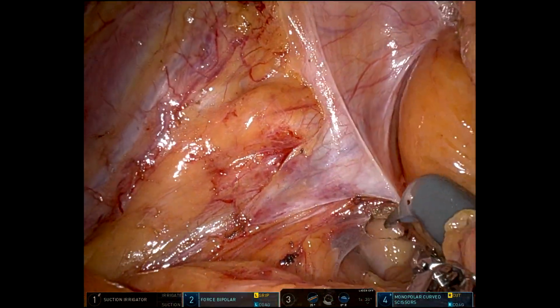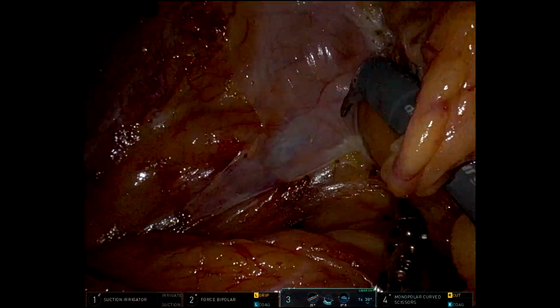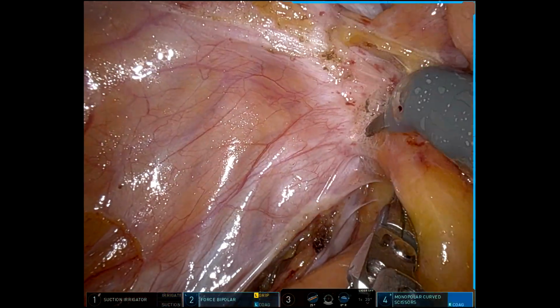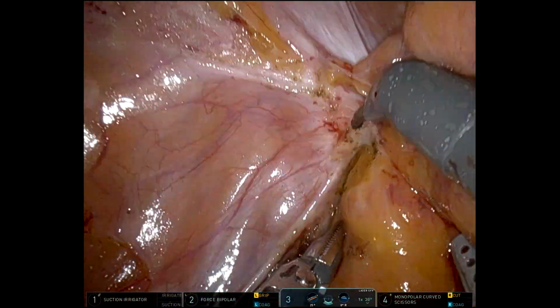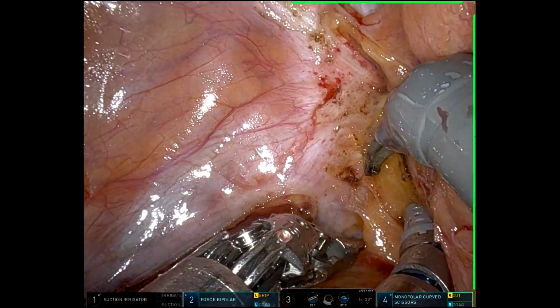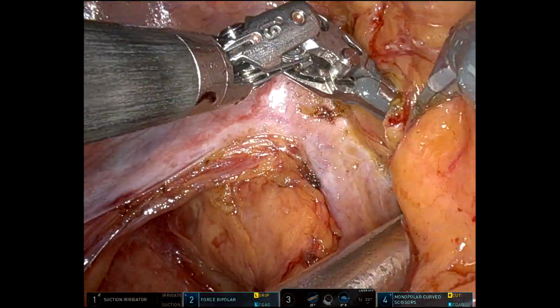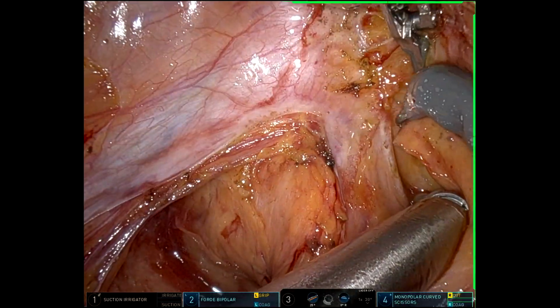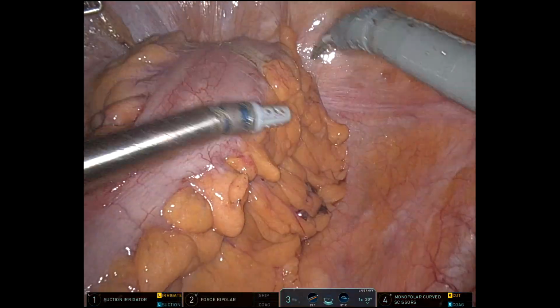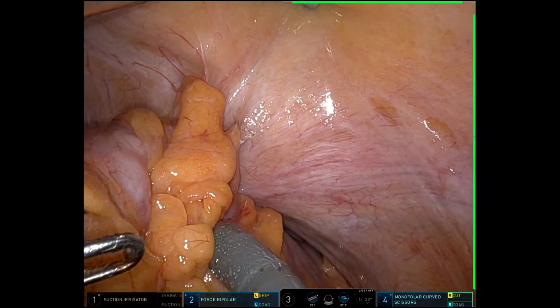So now I'm going to go down towards the pelvis and try to take down the adherence of the fistula. There's some adherence centrally around the dome of the bladder, but there's also some adherence towards the left and closer to the trigone than it looks. So I'm really trying to hug the colon and stay away from the lateral pelvic sidewall. I find that ICG in the ureters is extremely helpful for cases like this. We'll now go and attack the fistula from a central anterior position.